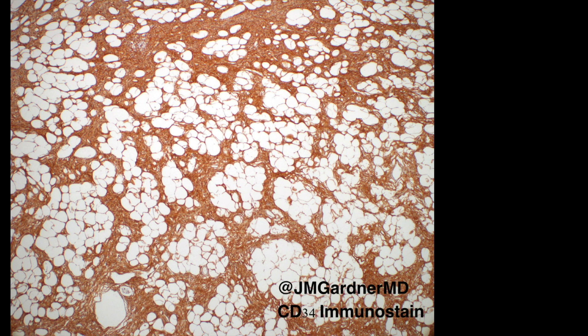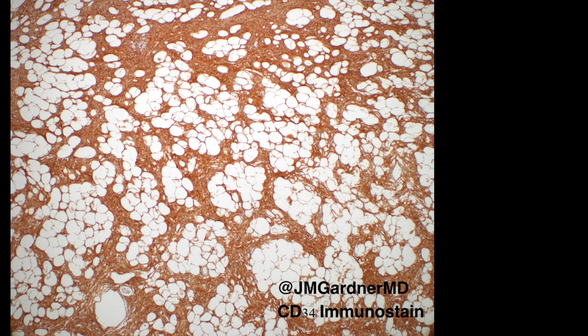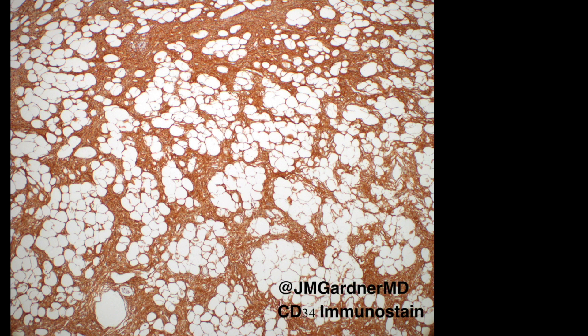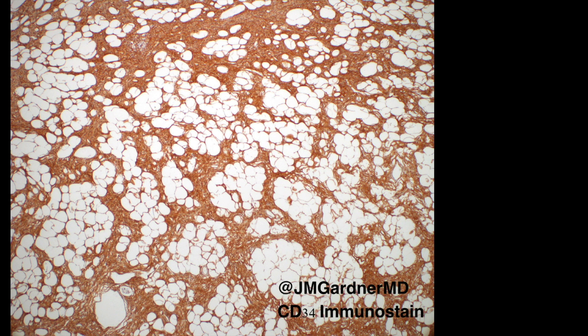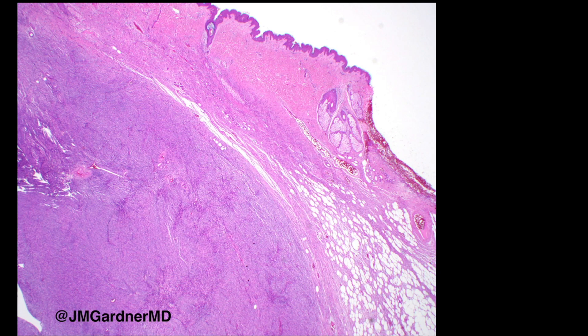CD34 is a very sensitive stain, positive in the vast majority of conventional DFSPs, but it is not specific at all. It stains many different fibroblastic entities and can also stain things like spindle cell lipoma, which can have morphologic overlap with DFSP. It's very helpful as a screening tool, but make sure CD34 doesn't lead you astray — it is sensitive but not specific.